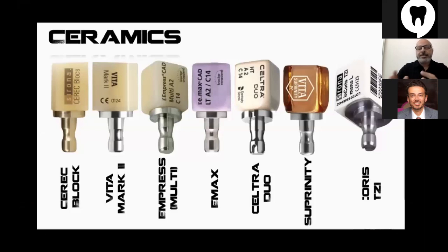These are just examples of the most common materials in the market, from feldspathic and leucite to lithium disilicate and zirconia-reinforced lithium silicates, and even zirconia materials. They are all blocks ready to use with the in-office CAD-CAM machine, the CEREC in particular on this occasion.